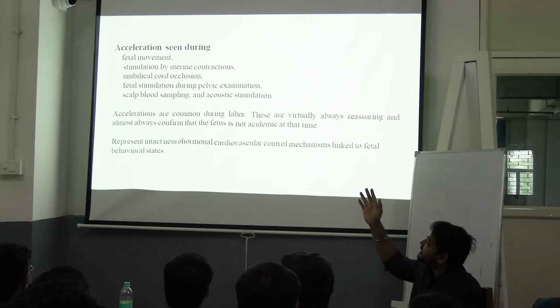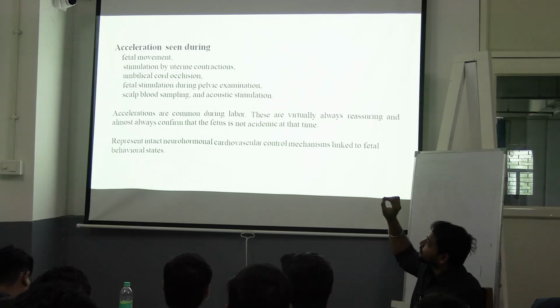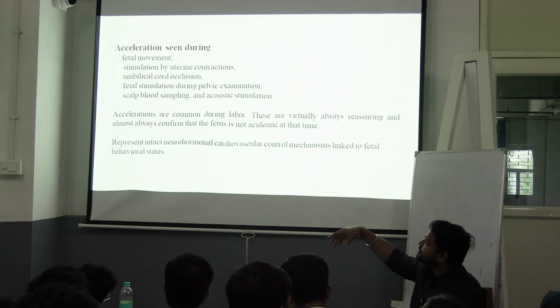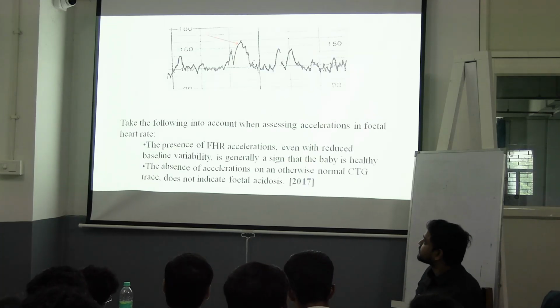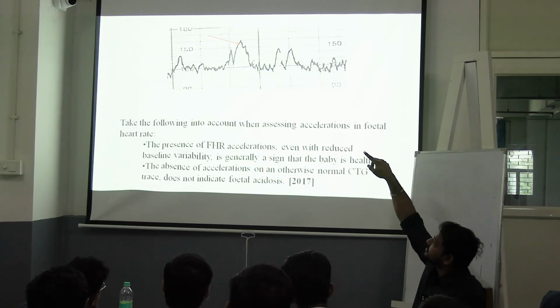So acceleration is seen in any fetal movement or stimulation, uterine stimulation. If you take any blood, or if there is umbilical cord occlusion in this and all. See, that is an acceleration. That pointer, that is an acceleration.